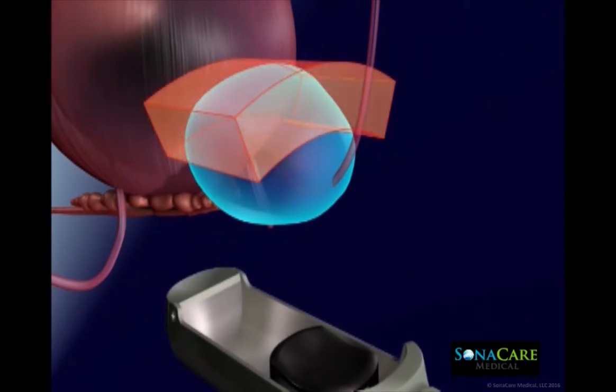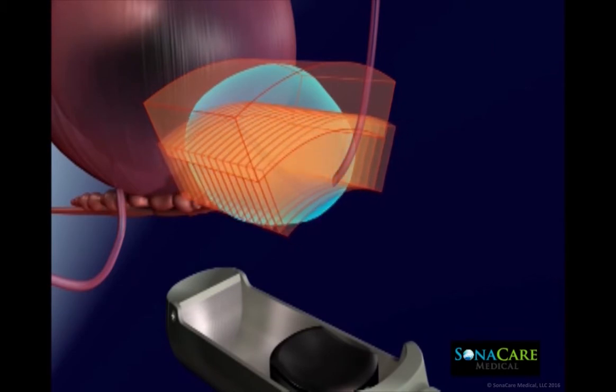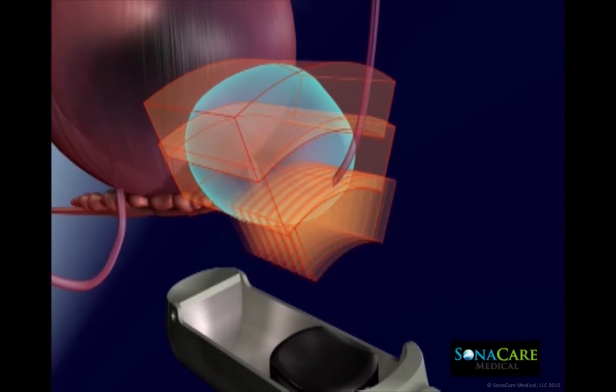In multiple ablation zones, the device makes use of integrated biplanar ultrasound imaging of real-time ablation planning, monitoring, and post-ablation imaging.